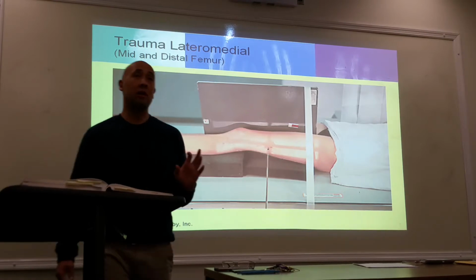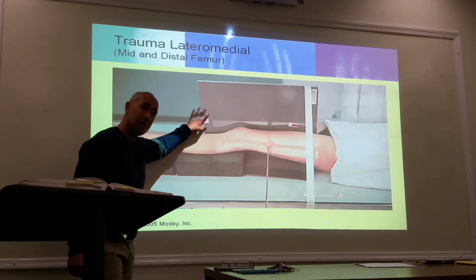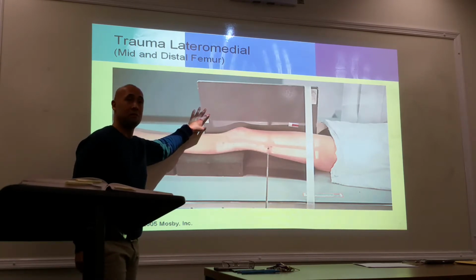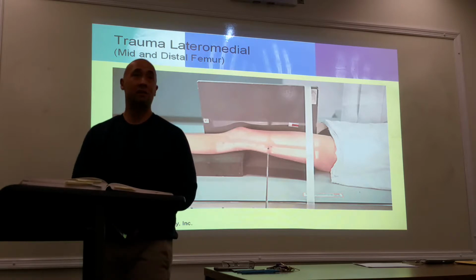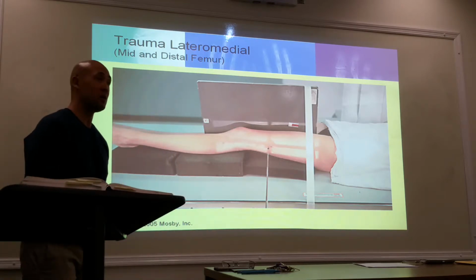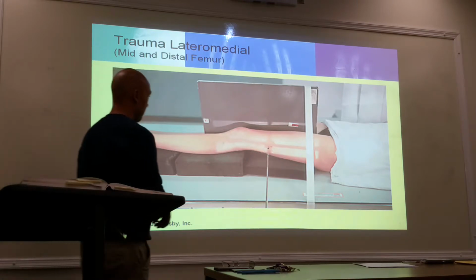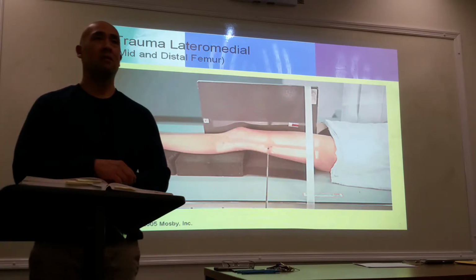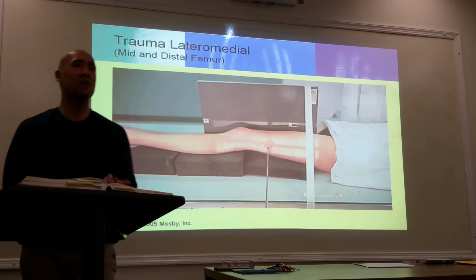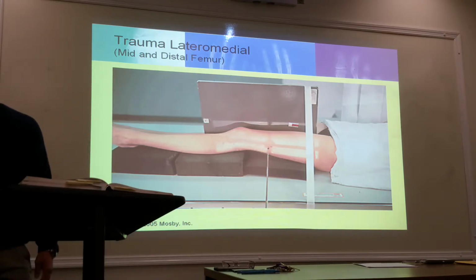And this is where, again, there's going to be some differences in your facility. They may or may not use a grid. Being that it's above the knee, should we use a grid? Yeah, because above the knee, for sure it's going to be greater than 10 centimeters in thickness, right? All right. Any questions here? What's our SID, by the way? We do everything at 40 unless we specify it. So this is done at 40 inches.